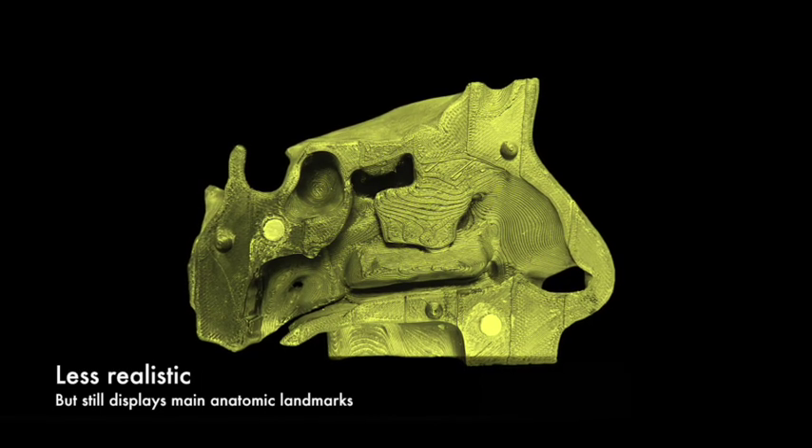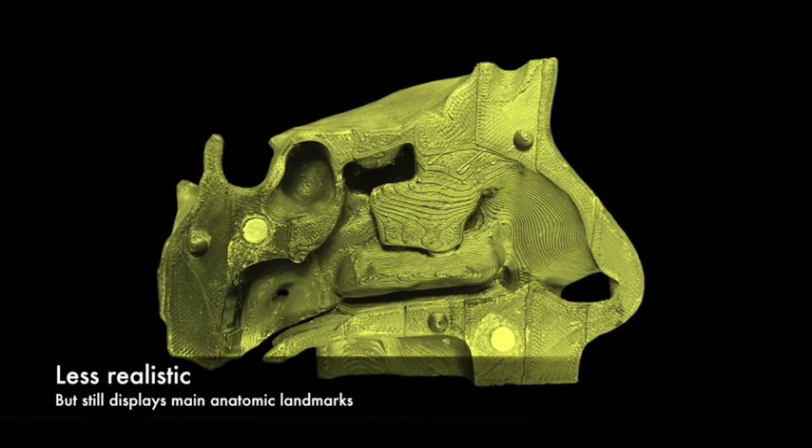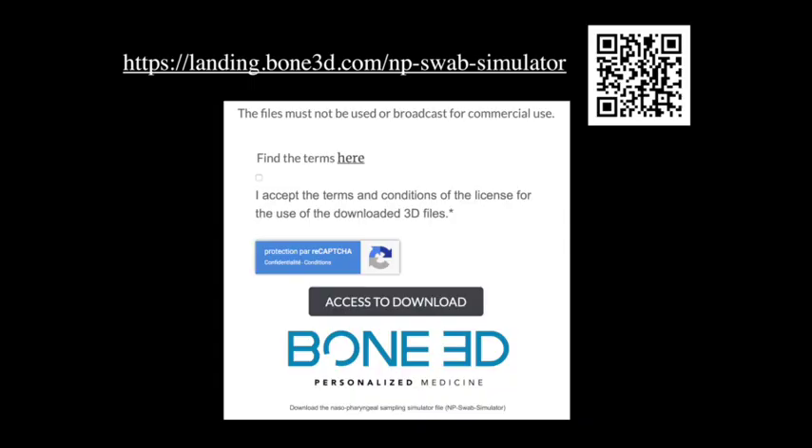Although this second model is less realistic, it displays main anatomic landmarks and allows nasopharyngeal swab collection. Comprehensive 3D files for printing and full instructions for manufacturing both models are freely available online via this link.